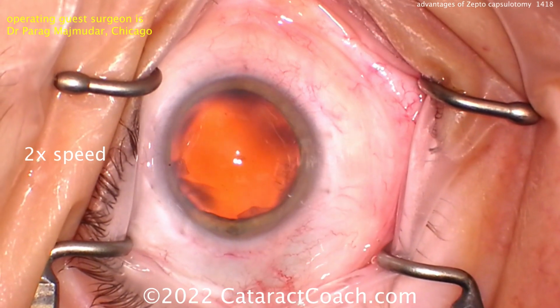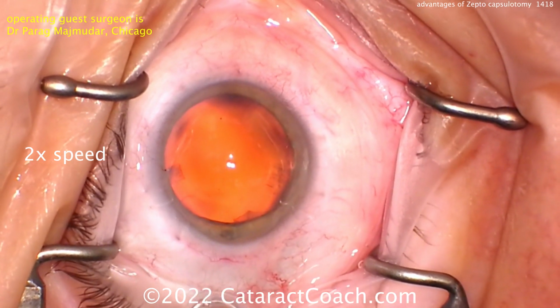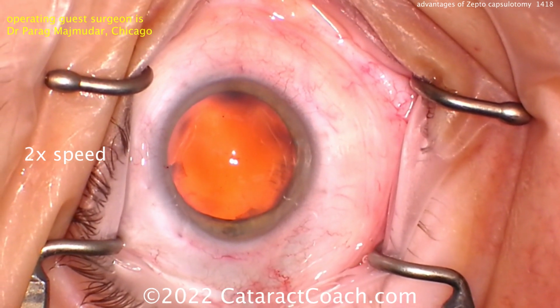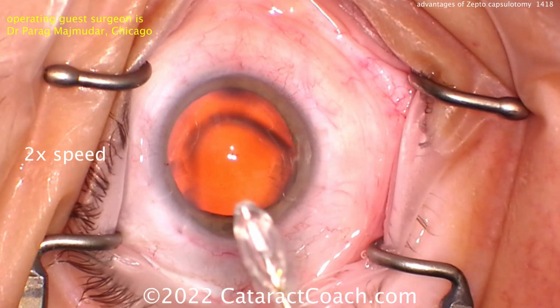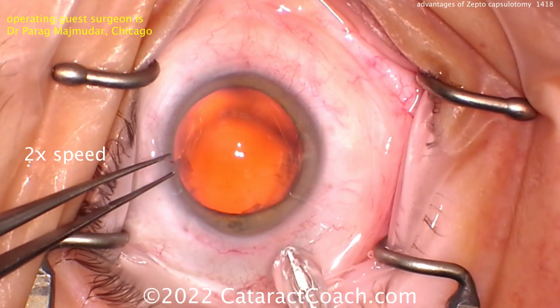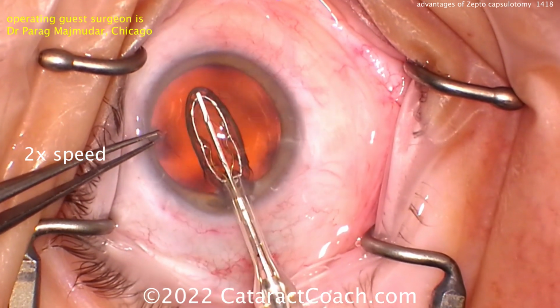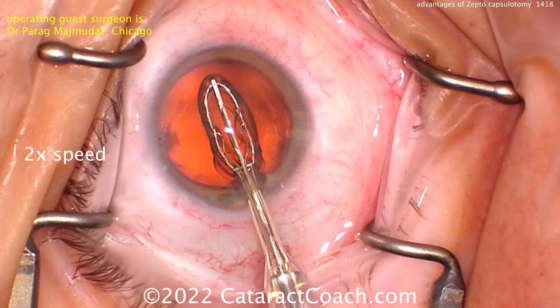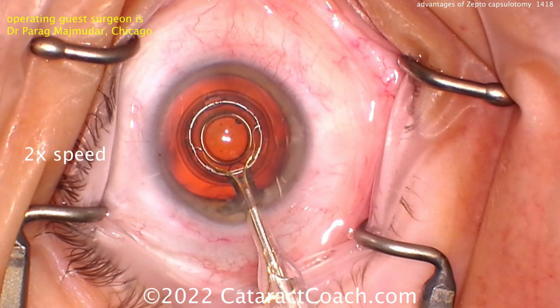In the Zepto device, you're going to use this to create the anterior capsular opening. And so this device has a nitinol ring that's collapsed initially, and you can see there it goes through your small incision, as small as 2.2, and you place that inside the eye, and then you can open and expand the ring. There it is, about a 5 millimeter capsular opening comes up. There it is, expanded to round, and you center it up wherever you want.